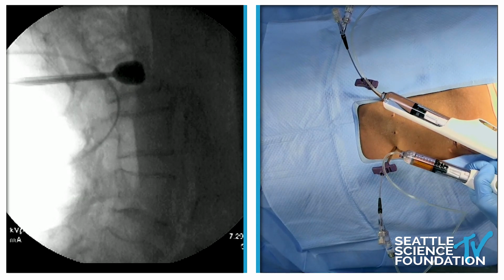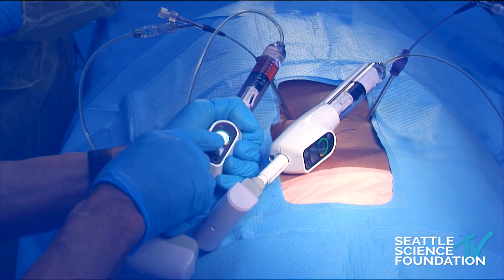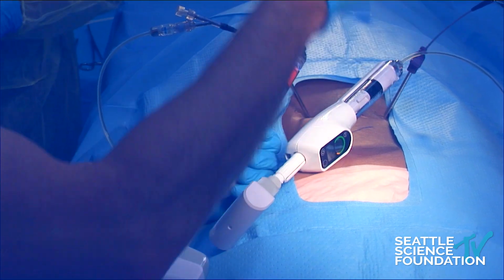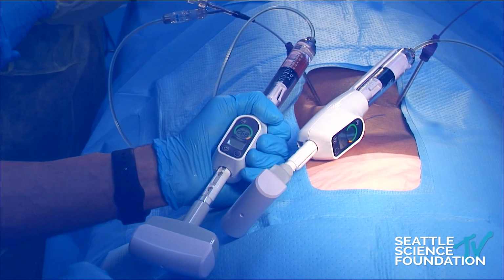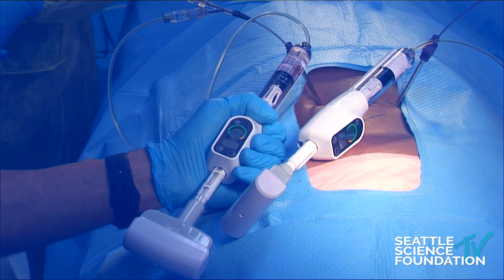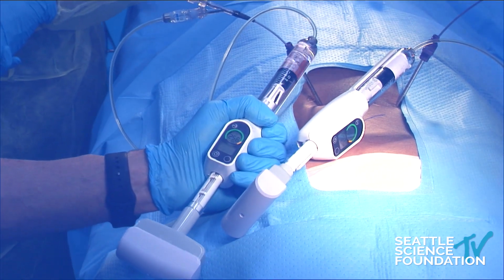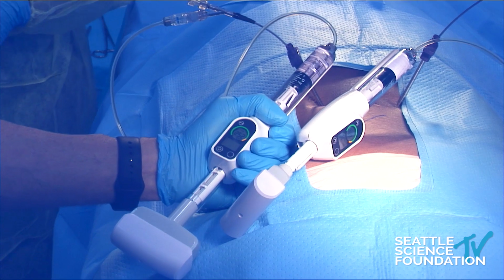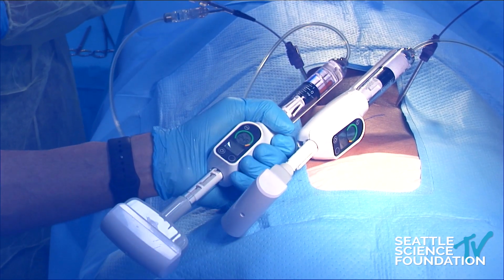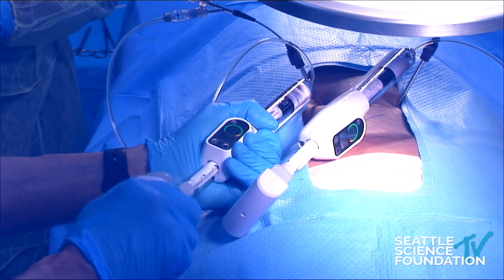So I'm blowing up the balloons bilaterally here on both sides. You can see the pressure gauge. These are Express, let's go back, AP, and they are rated to 700 PSI. Functionally, these are nylon balloons. You can blow them up. They're rated easily to 1,000 PSI, no problem. But the FDA rating is rated at 700. And so we will see where we are, and these are looking shockingly pretty good.